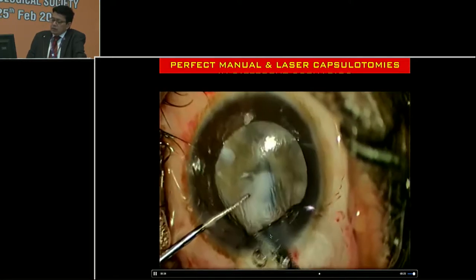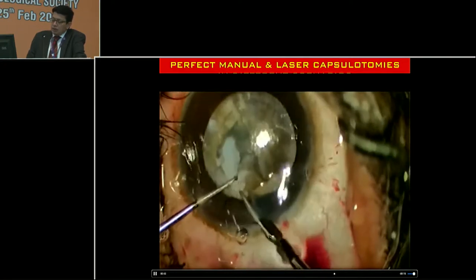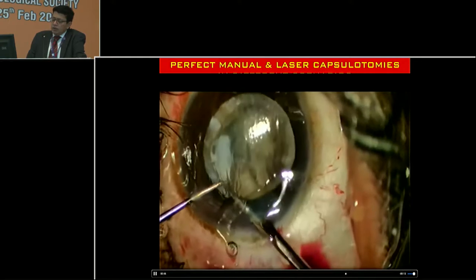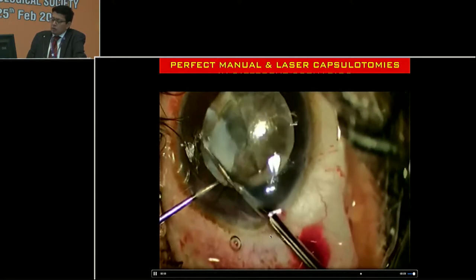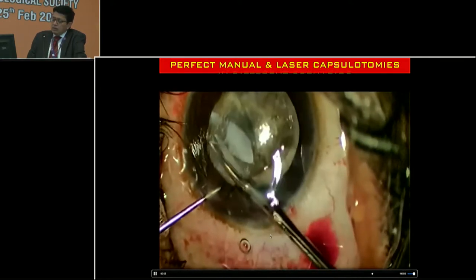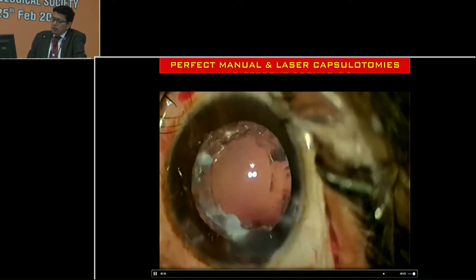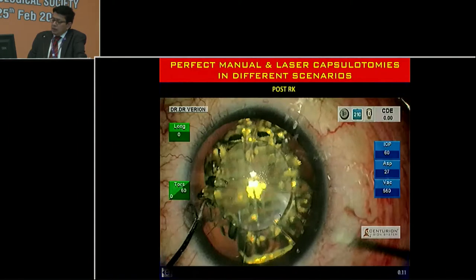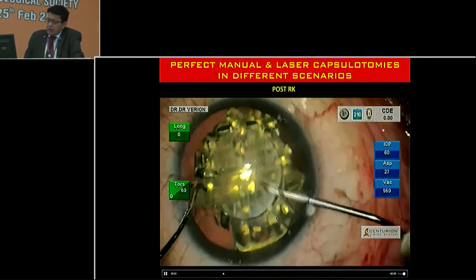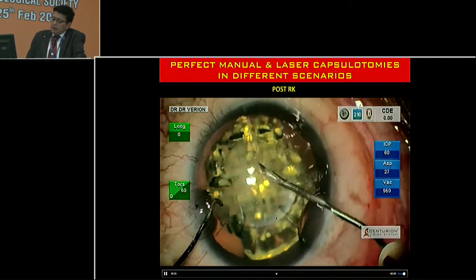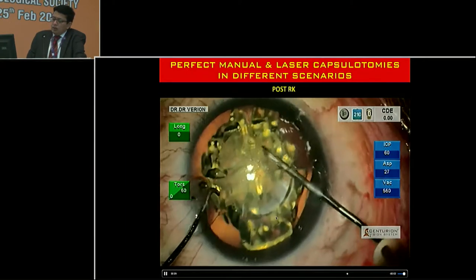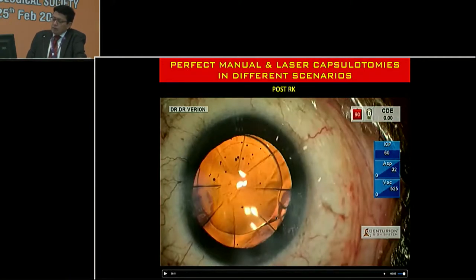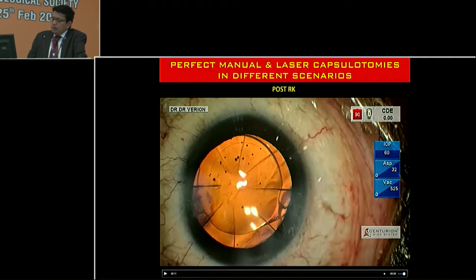Even though you have the best technology, combining different techniques to optimally address each case is extremely important. In a post-RK situation, laser light may not pass through the RK incisions. The first eye went well, but in the second eye, even when confident of a free rhexis and using the down-up technique, a rhexis run-off occurred corresponding exactly to the area of the RK incision — fortunately not wrapping around, so the lens could be implanted in the bag. In a post-ICL situation, you need to adjust the offsets to compensate for the ICL optics, and femtosecond can be used to create the rhexis with the ICL in place.